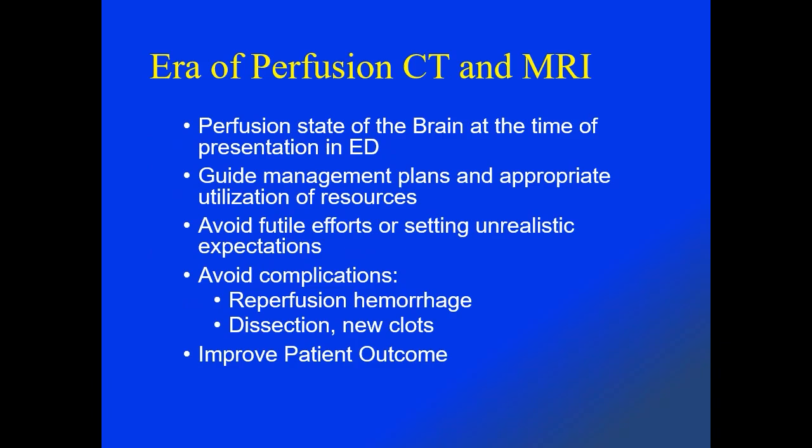Information about the perfusion state of the brain at the time of presentation is vital in guiding management plans and appropriate utilization of resources, and helps avoid futile efforts or setting unrealistic expectations. It can also help avoid complications such as reperfusion hemorrhage, arterial injury, or emboli into new territory, and ultimately the information can help improve patient outcome.